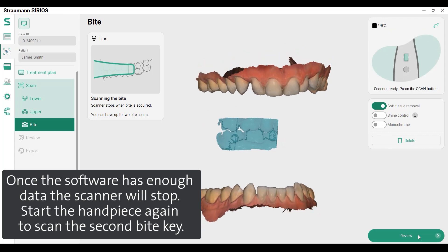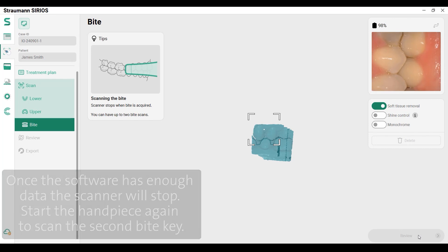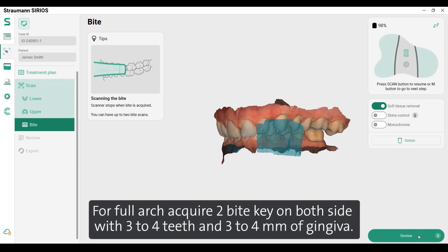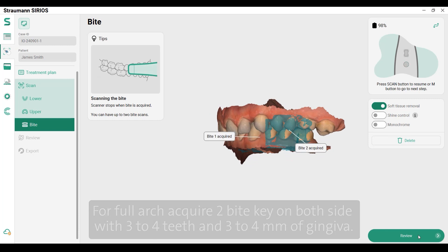Start the handpiece again to scan the second bite key. For the full arch, acquire two bite keys on both sides with three to four teeth and three to four millimeters of gingiva.